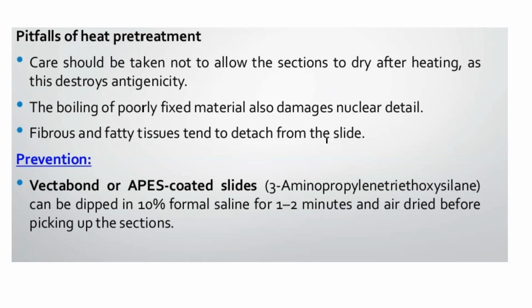So the steps that we follow in immunohistochemistry need to be very cautious. These are sensitive techniques because the sample is very limited. It's not a blood or urine sample that we can collect again and again from the patient. So we need to be very careful when we are doing the tests. We should not damage the tissue, or encourage such misconduct during the performance of this test.